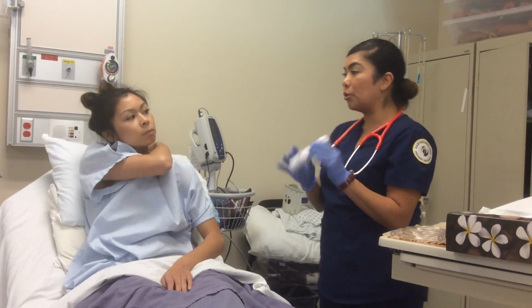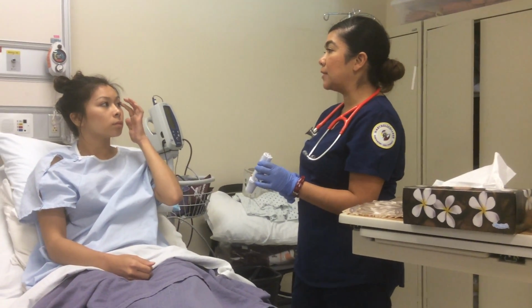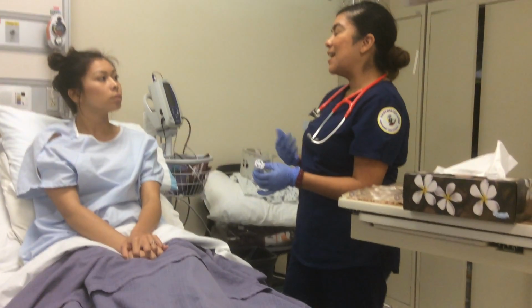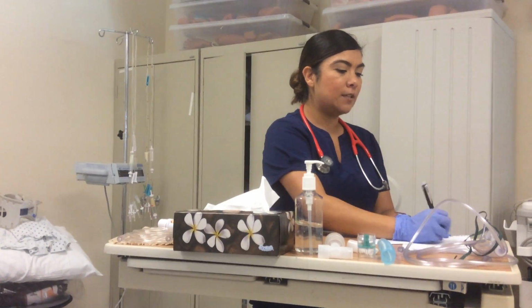Okay. Now I will let you know we're going to be performing this again after your medication, and the reason for that is that we want to make sure that we see a 20% increase, and if there is a 20% increase, then that's an indication that the medication is working. Okay, so let me just write this down. That was 400.